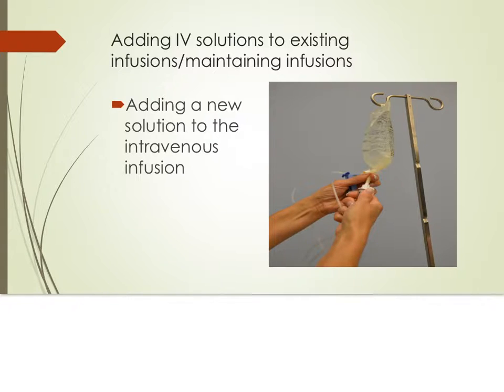Remove the cover from the IV tubing port on the new container and insert the tubing spike into the new container. Check for any air bubbles in the tubing. Check the flow rate and make sure it is flowing according to the prescribed rates. Add a time strip to the bag if this is a gravity infusion, or if an electric infusion device is being used, program it with a new volume to be infused.